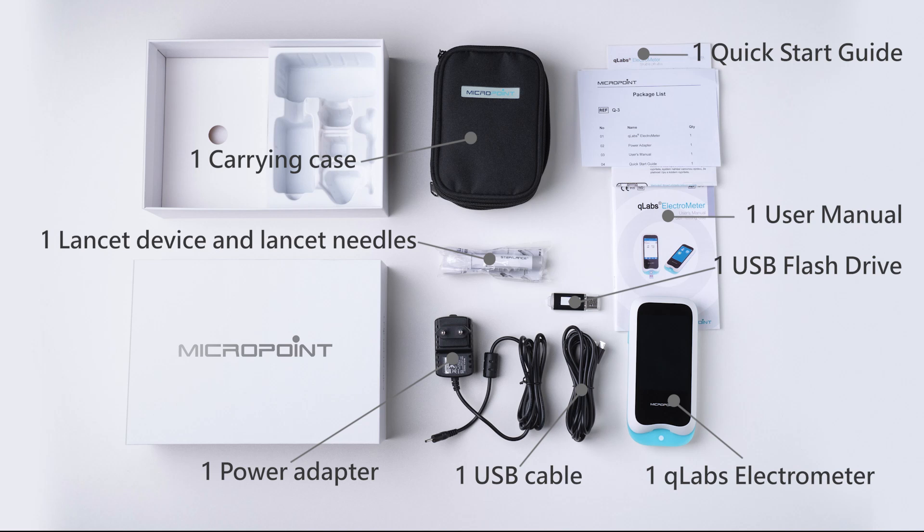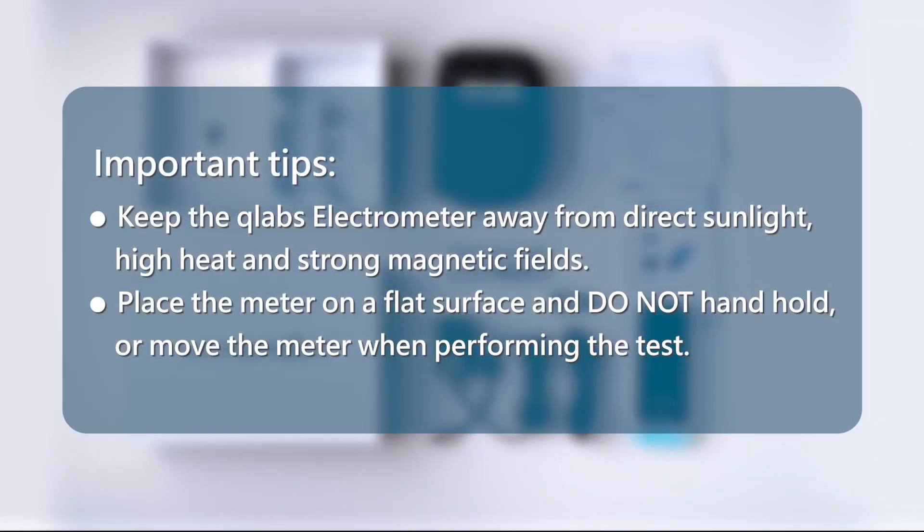The package also includes one Lancet Device and Lancet Needles. Important tips: keep the Q-Labs Electrometer away from direct sunlight, high heat, and strong magnetic fields. Place the meter on a flat surface and do not hand-hold or move the meter when performing the test.